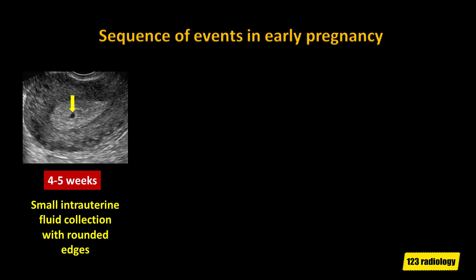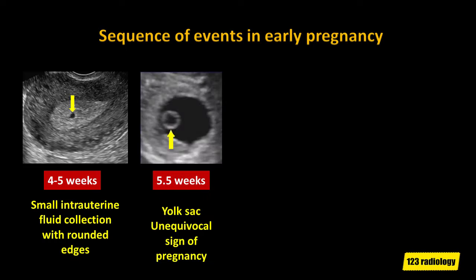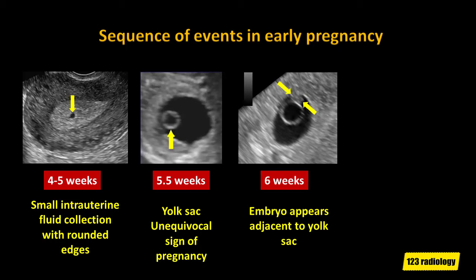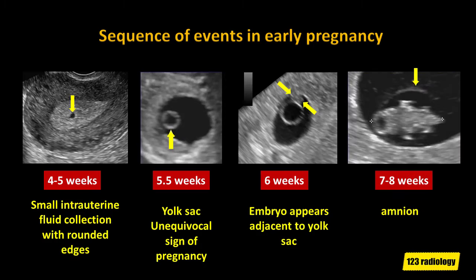Here is the sequence of events in early pregnancy. On the image on the left, we have a very small intrauterine fluid collection with rounded edges, and that is one of the earliest signs of intrauterine pregnancy. Next we have a sac that contains a yolk sac, and this occurs at 5½ weeks of pregnancy — this is an unequivocal sign of a pregnancy. Then an embryo appears at 6 weeks adjacent to the yolk sac, and usually we get a flicker of cardiac activity at this time. Later on at 7 weeks, we see an amnion surrounding the embryo.